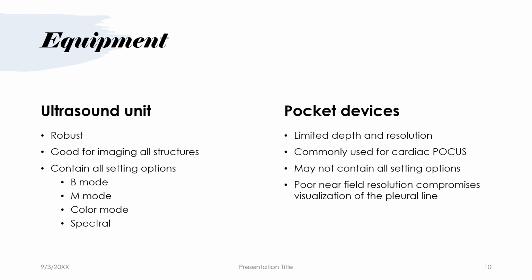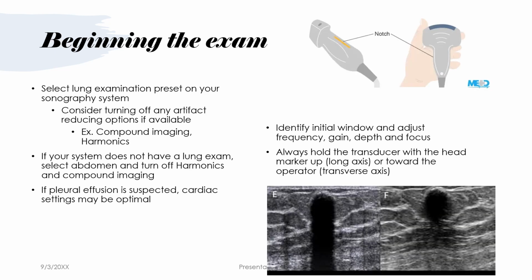So just if you're shopping for equipment, make sure you're asking the right questions and that you're having them demonstrate the equipment on anatomy that you really want to see. Know what you're looking for, so that you can assess if that equipment's going to do the job for you or not.